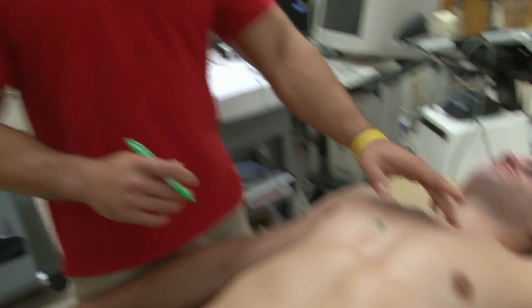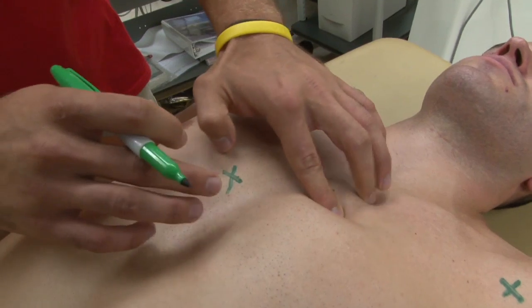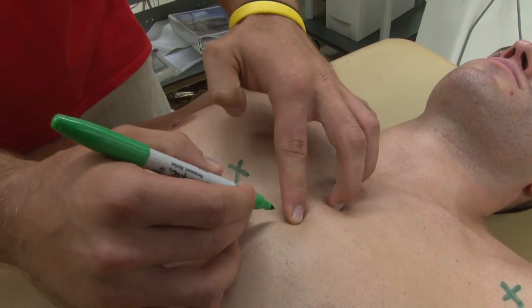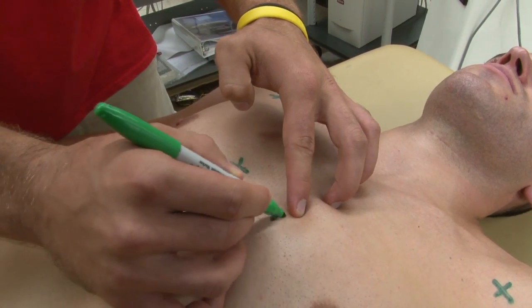The V2 lead is at the same level as the V1 lead — the fourth intercostal space — but it's going to be on the left side of the sternum. First, palpate the clavicle and go down to the fourth intercostal space, then mark that.